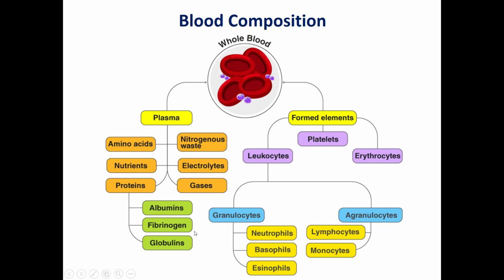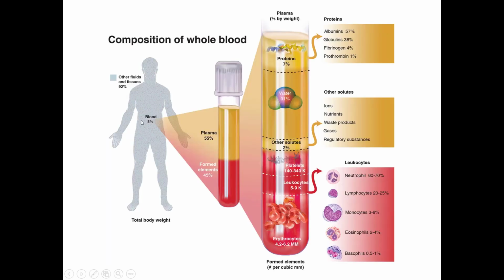We have also the coagulation analyzer to study the impacts of these coagulation proteins and so on. So each part of the blood, we have a different machine for it. So now, what is the blood? What is the plasma and serum?